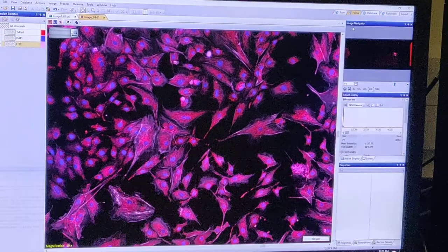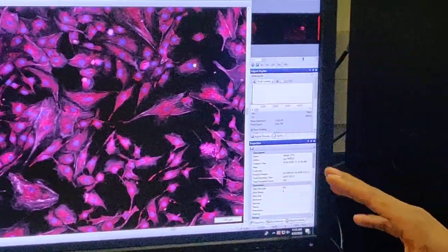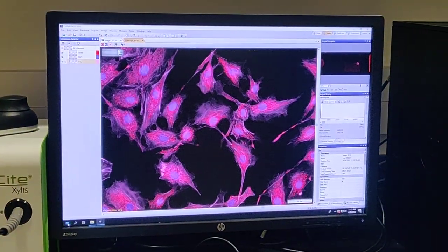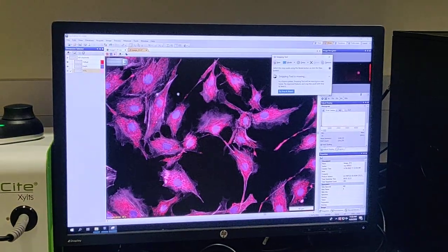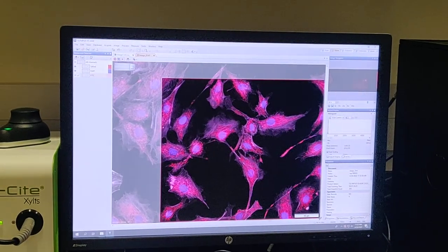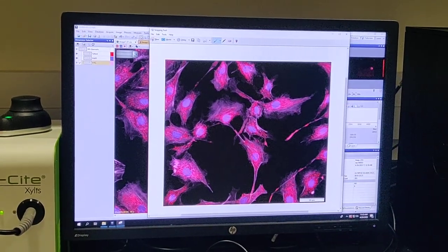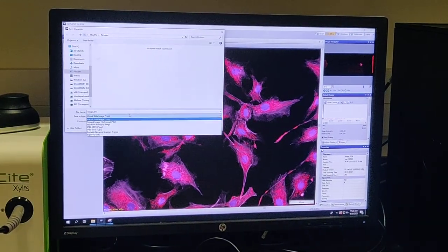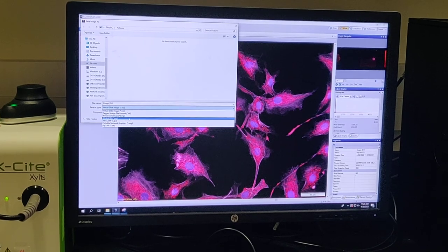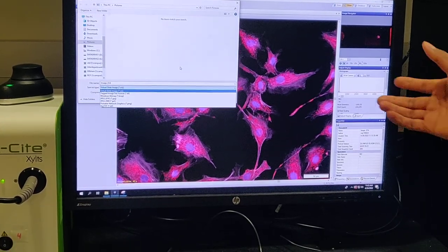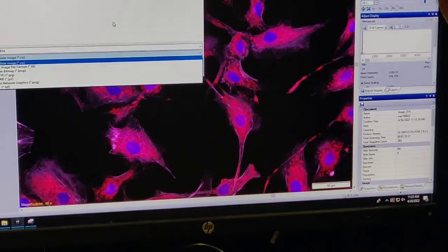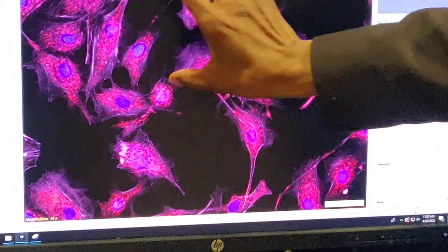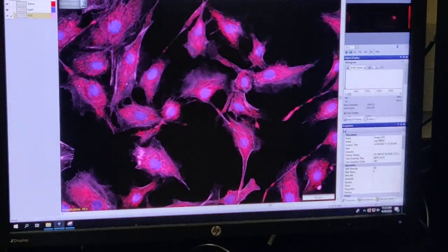If people say the file is too large, I suggest zooming into the area of choice, adding a scale bar, and using the snipping tool to take a screenshot. Alternatively, go to File → Save and save as VSI or BigTIFF — BigTIFF can be opened in Fiji. You can also export as a TIFF series, but it will be a giant file — hundreds of megabytes or even gigabytes. For example, this image is 15,000 by 15,000 pixels from stitching many 40x frames (each 2k × 2k), plus the 2x overview on top.